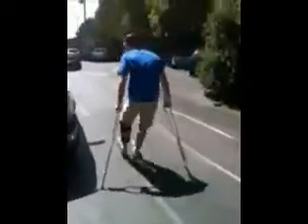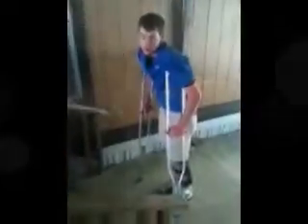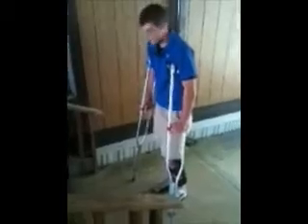And that's how you walk on crutches. Alright, so now I'm going to teach you how to walk upstairs. When you crutch the stairs, you want to go strong foot first, and then you're crutching. So you're going to put your foot up and bring the crutches up with you.